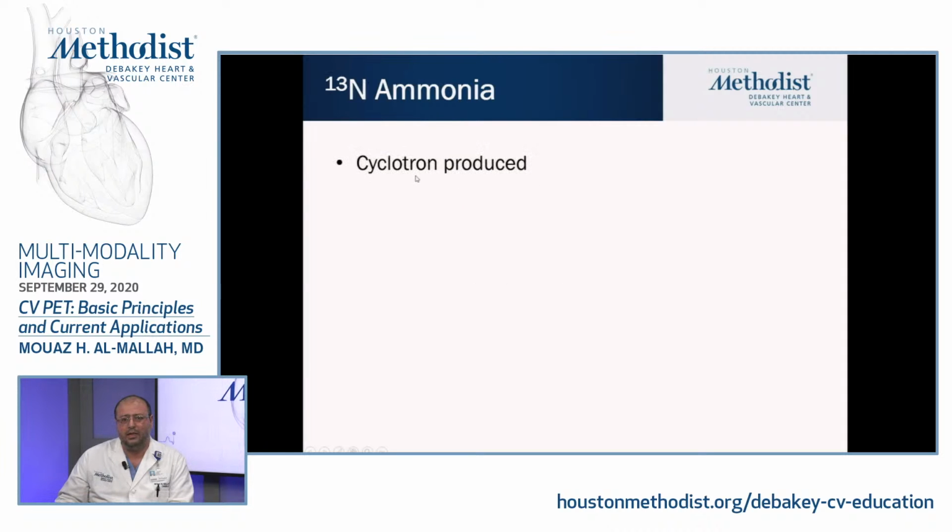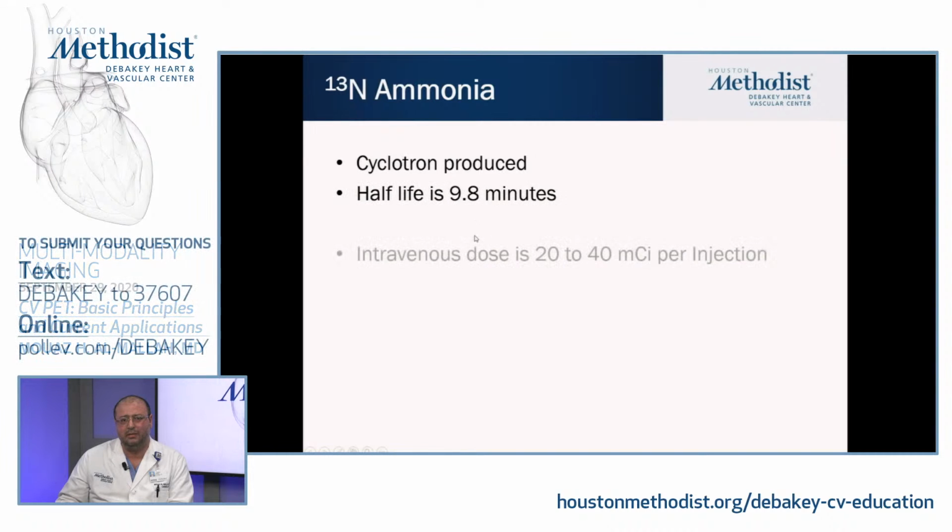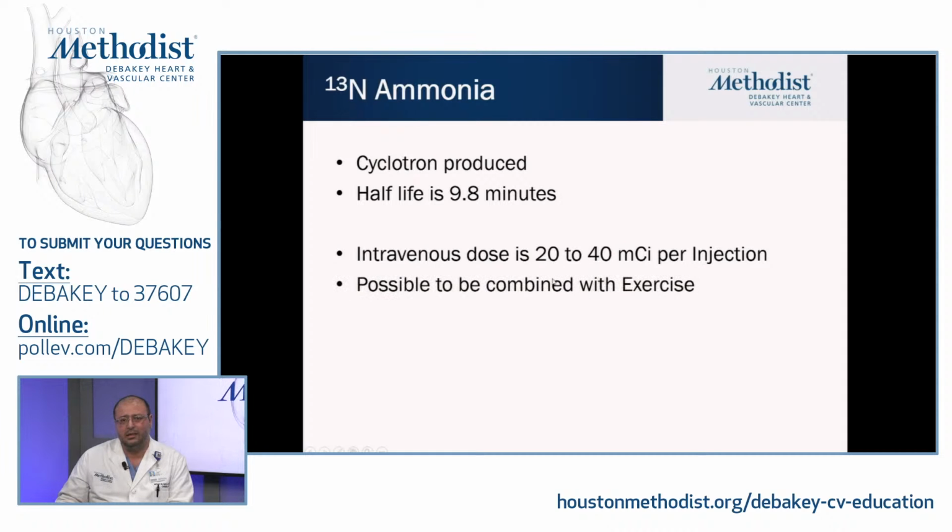N13 ammonia is cyclotron produced, as I mentioned. The half-life is 9.8 minutes, almost 10 minutes. And you can inject it at rest and stress. Some sites do it with exercise, although it's a little bit more cumbersome. But if you want to use anything with exercise nowadays, it will be ammonia.